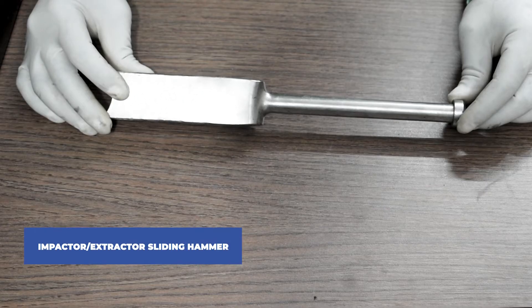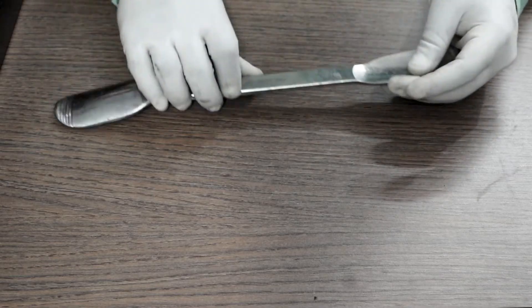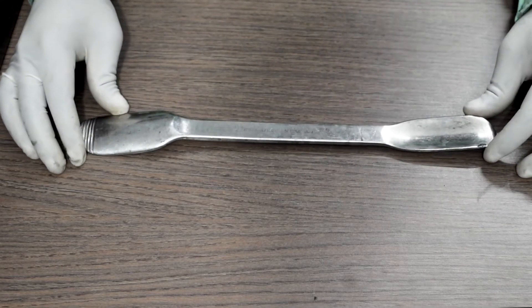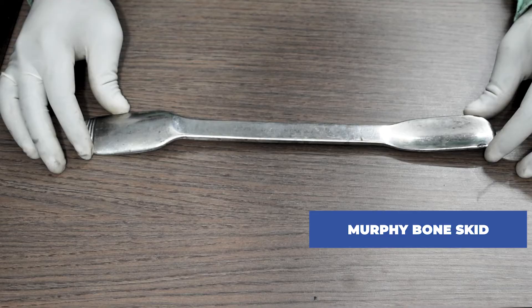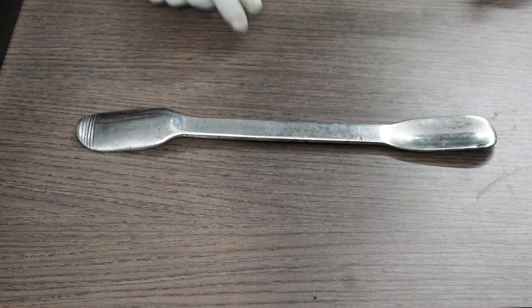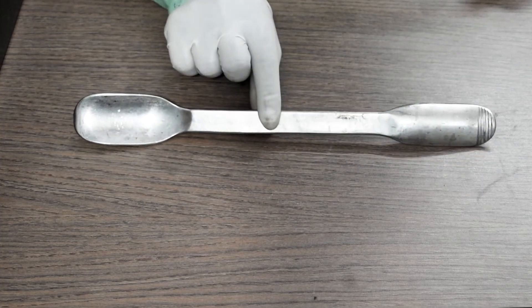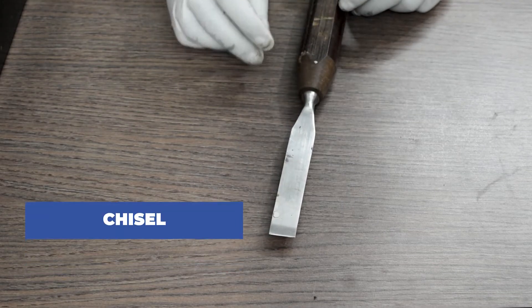This is called an anteversion instrument. This one is called an impactor extractor sliding hammer. This device is known as Murphy's Bone Skid. Up next, this is a chisel.